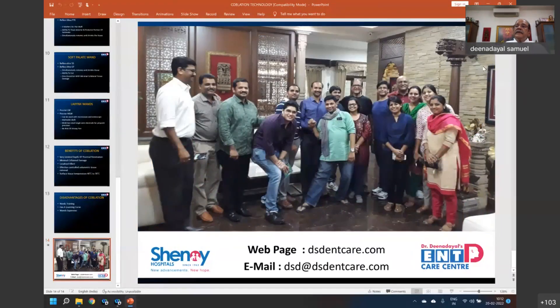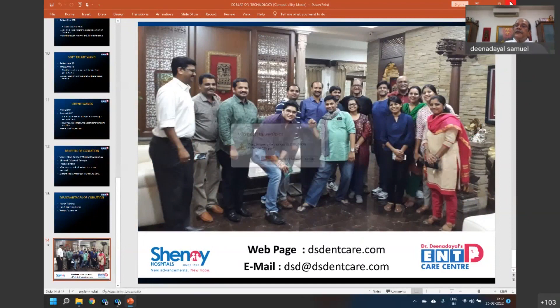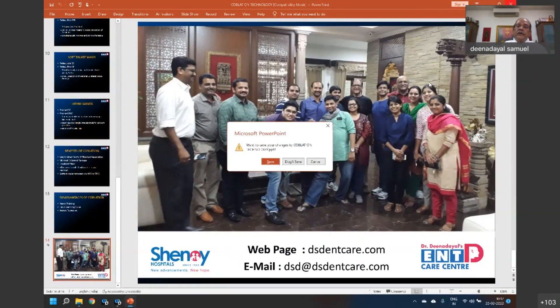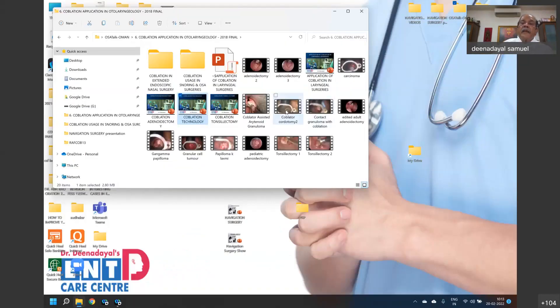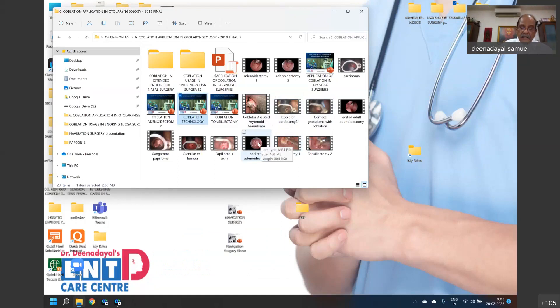Going back to the presentation, I will show a few videos. I'll start off with something as simple as a pediatric adenoidectomy.